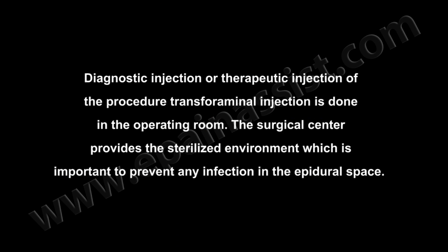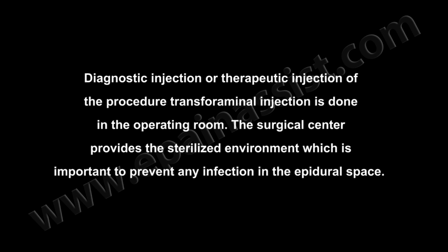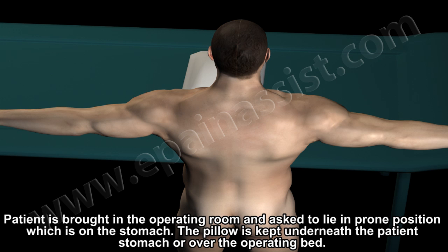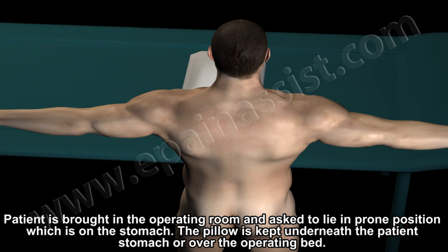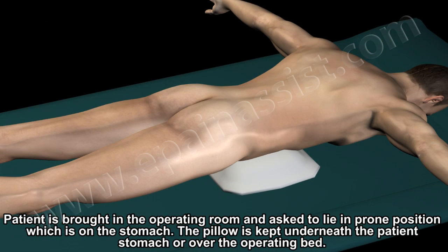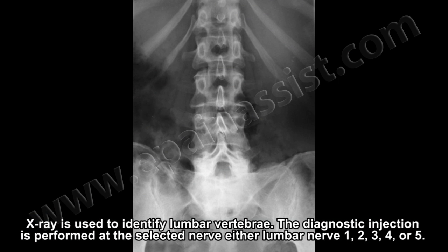The transforaminal epidural injection procedure is done in the operating room. The surgical center provides a sterilized environment, which is important to prevent any infections in the epidural space. The patient is brought into the operating room and asked to lie in the prone position, which is on the stomach. A pillow is kept underneath the patient's stomach over the operating bed. X-ray is used to identify the lumbar vertebra.